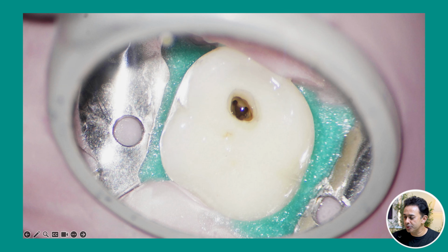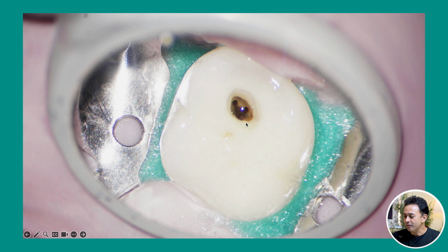And in addition to using the rubber dam, if there are spaces between the rubber dam and the tooth, then you can seal that with some sort of a gingival protective barrier like Opaldam or any sort of a gingival protection barrier that you get commercially. You can use that to seal those spaces around the tooth so that even if some hypochlorite leaks out from here, it doesn't go and harm the oral tissues around. So this is really, really important.